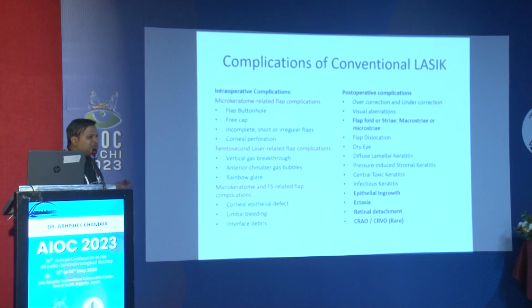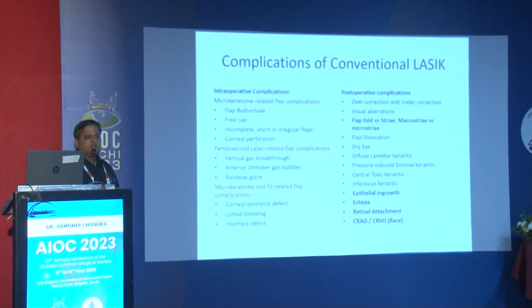So I would say that LASIK is a very, very safe surgery, but still there are some amount of complications usually associated with the microkeratome.